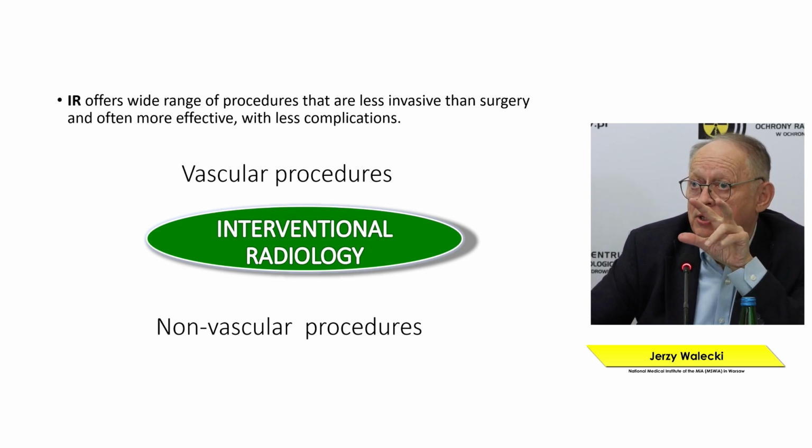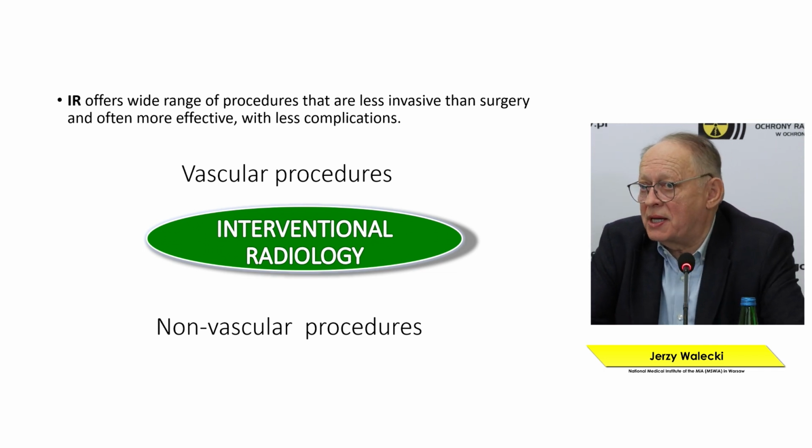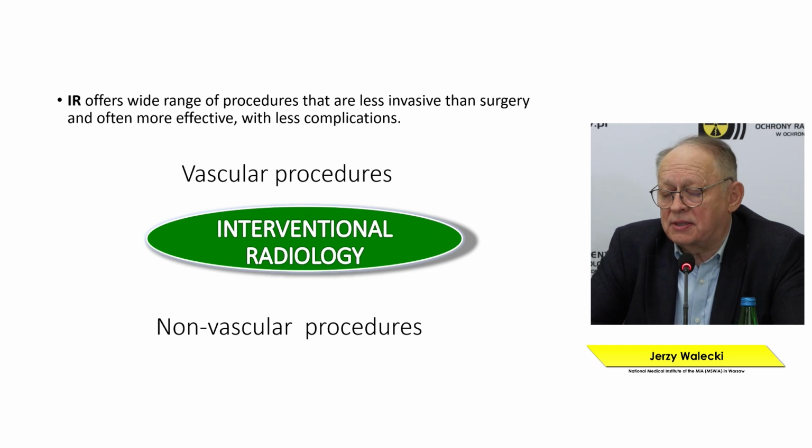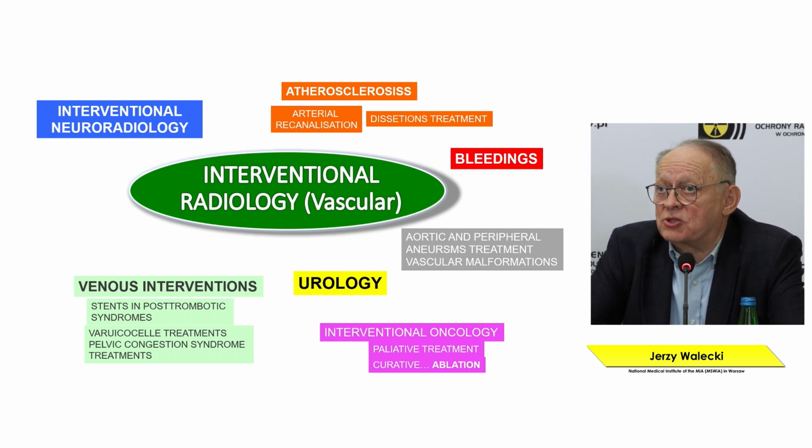Interventional radiology can be divided into vascular, endovascular, and non-vascular procedures, such as ablations or other techniques of drug administration. So these are all these vascular applications of interventional radiology.